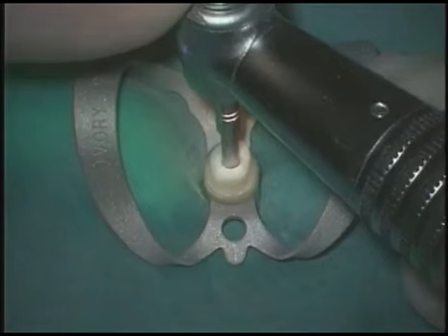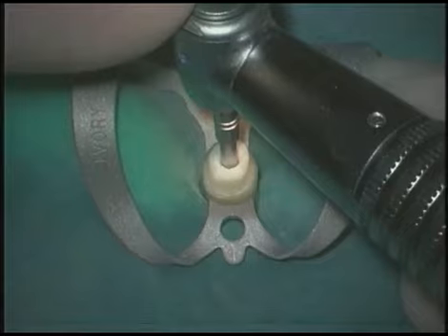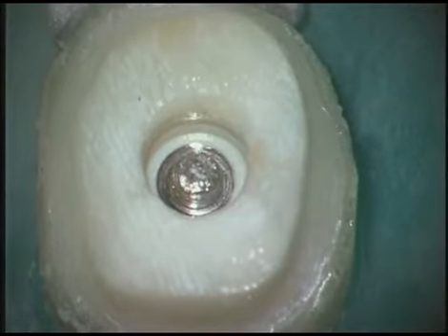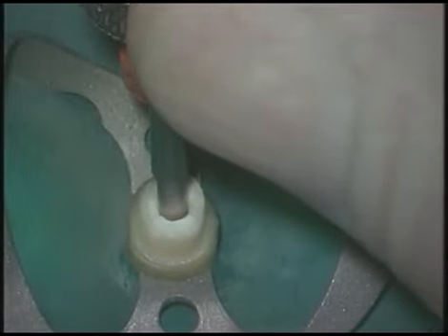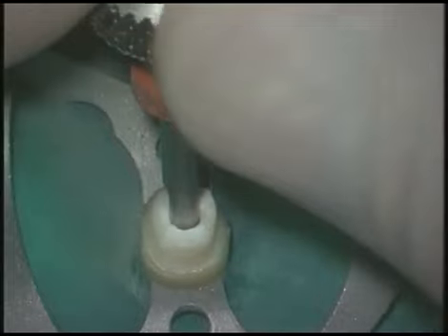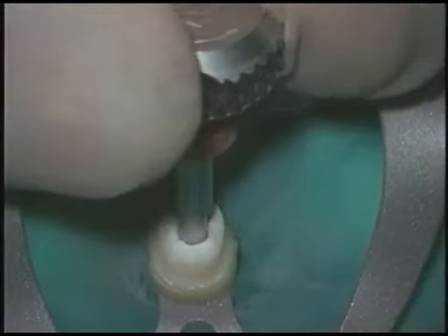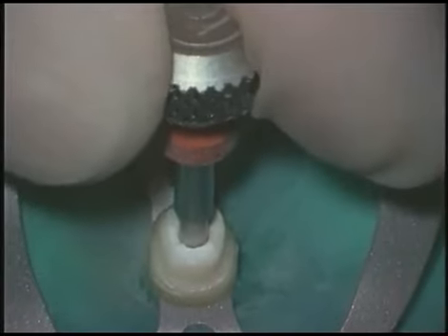The Cavo slow-speed electric handpiece can use a trephine to machine down. I'm going to machine down more of the post, which will preserve lateral dentin. The post is only machined down approximately 1 millimeter. Now the appropriately sized tubular tap is brought into place. Counter rotations, counterclockwise, begin to engage and draw the tap down. In this instance, we're probably only generating 3 or 4 threads on the post.